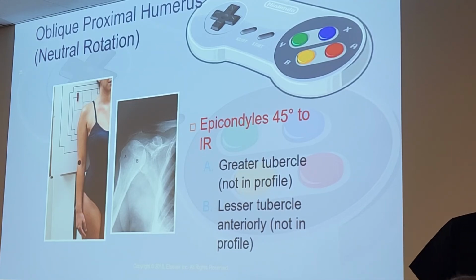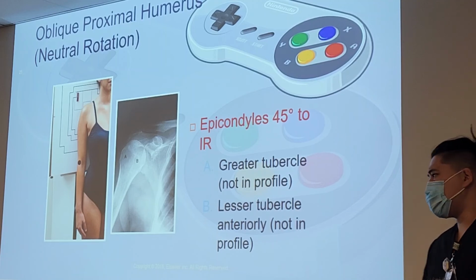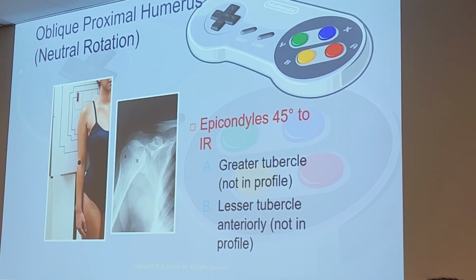Would it also tell us whether or not they are okay to use digital markers in the protocol book? Visual markers? Because I had a text say that's what we have to do, as opposed to, like, that's just what we do. Interesting. No, I mean, I think most places prefer you to use anatomical markers, actual physical markers.